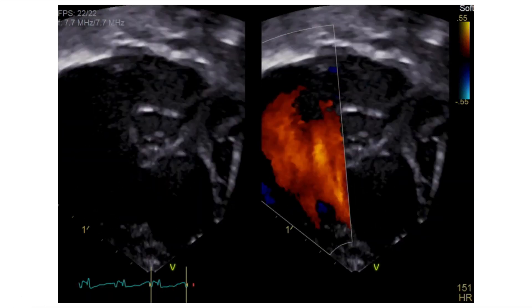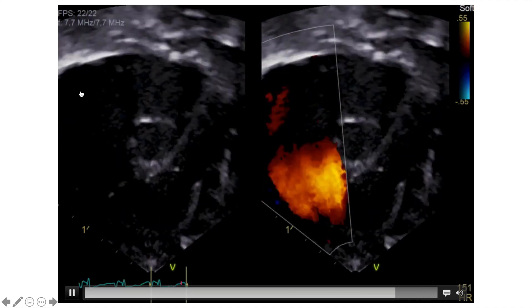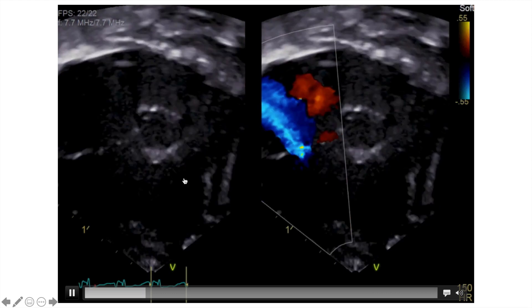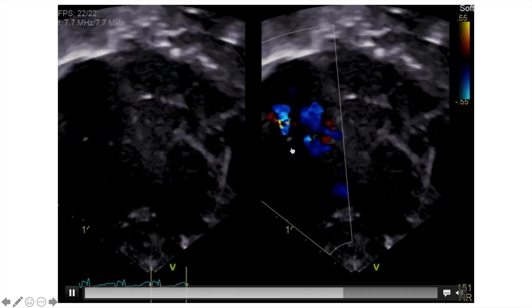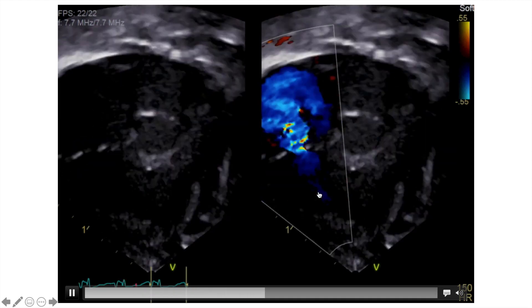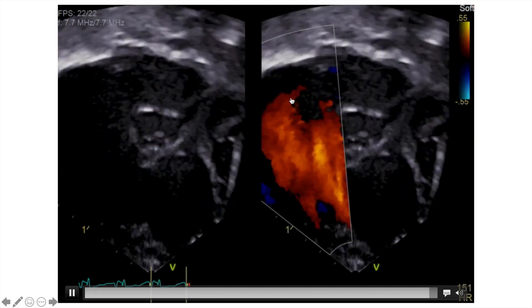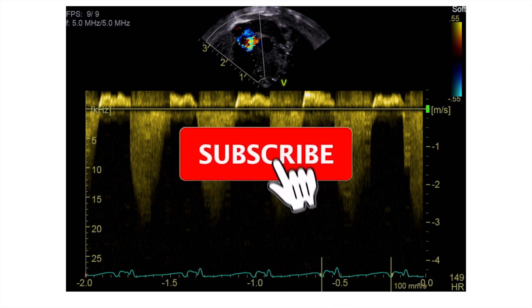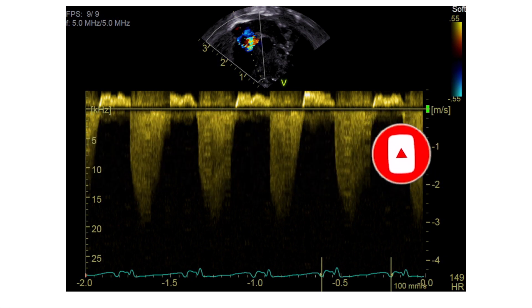The last view from which you can check the TR jet is the RV three-chamber view. On the 2D image, the aorta is in the middle, the right atrium and body of the right ventricle are visible, along with the RVOT. With color, the red flow represents blood from the right atrium towards the right ventricle, and the blue flow represents blood from the right ventricle towards the right atrium — the TR jet. We then check the velocity and apply the modified Bernoulli equation to calculate the RVSP.